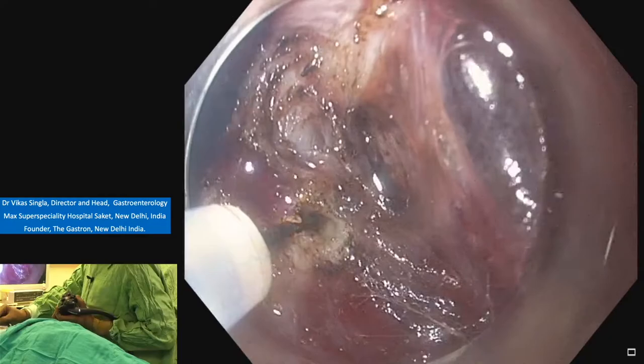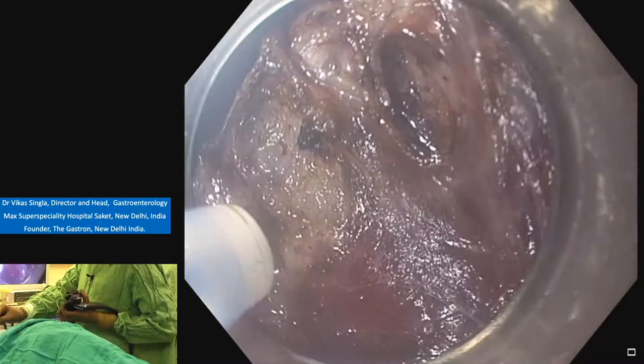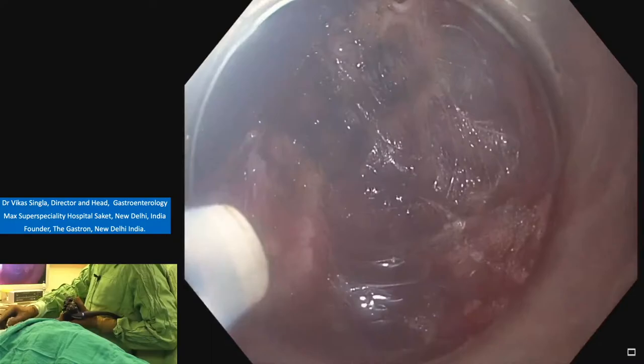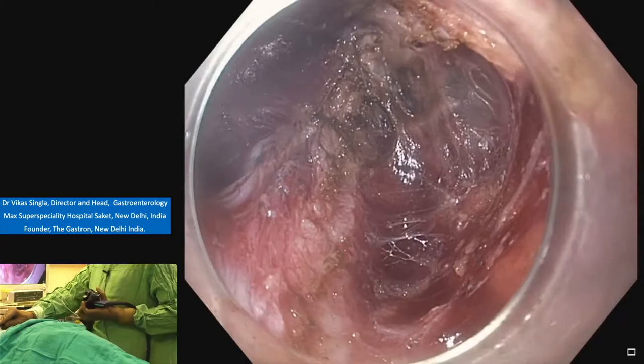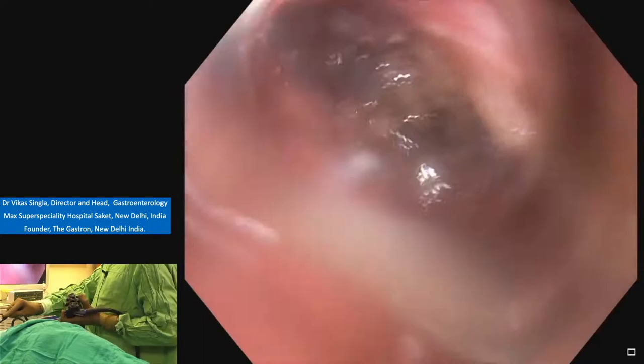And in there, out. Very carefully cutting. Careful dissection, last part. That completes the myotomy. Now we'll watch the tunnel and see for any vessel or ooze there.